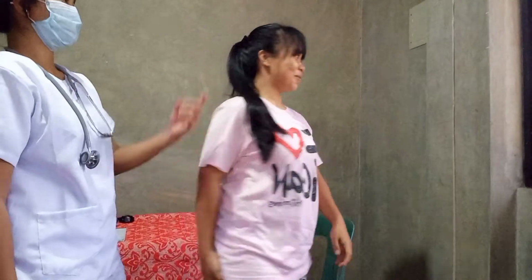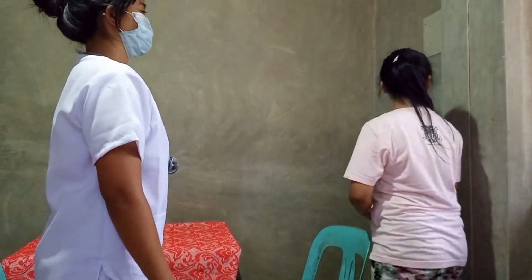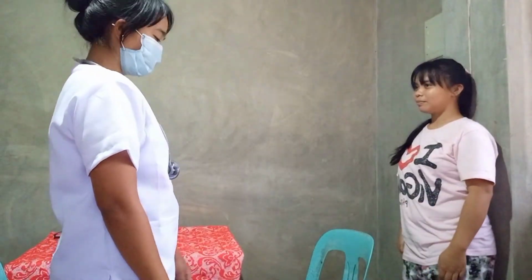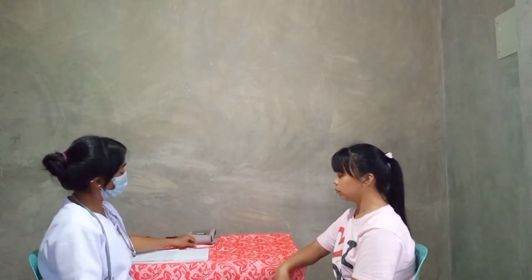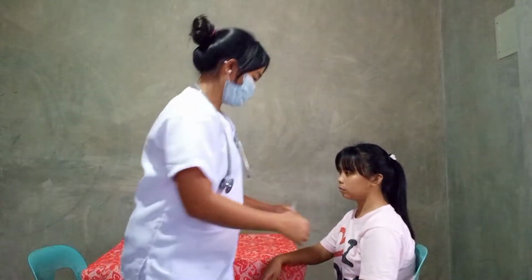So as I am assessing your general status, all we're gonna do first is get your height and weight. Can you please stand up? Go there. Okay, your weight. Okay, good. So we will be comparing your height and weight with your previous medical record, okay? And now I will be checking your vital signs, and we go first by getting your temperature, okay?